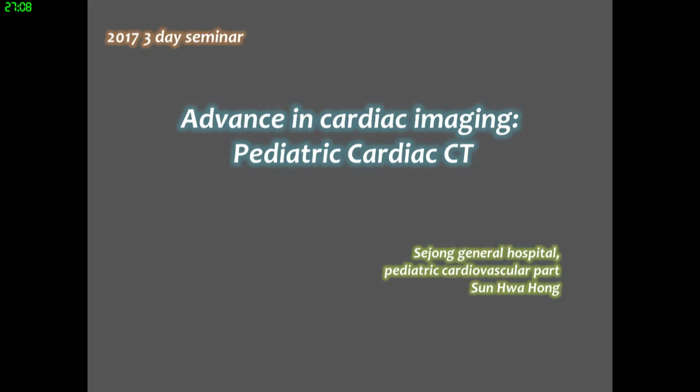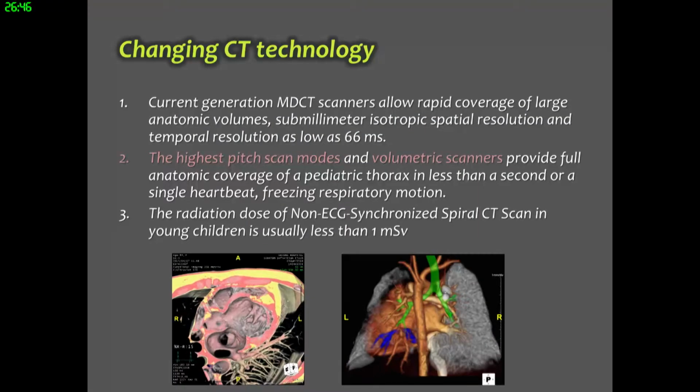In this session, I'd like to introduce the advanced cardiac CT scan for diagnosis and treatment planning in patients with pediatric congenital heart disease. Current generation MDCT scanners allow rapid coverage of large anatomic volumes, submillimeter isotropic spatial resolution, and temporal resolution as low as 66 milliseconds.